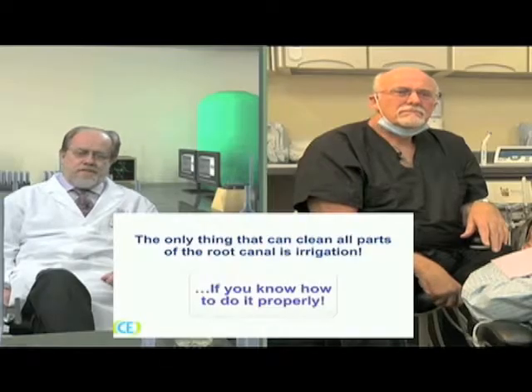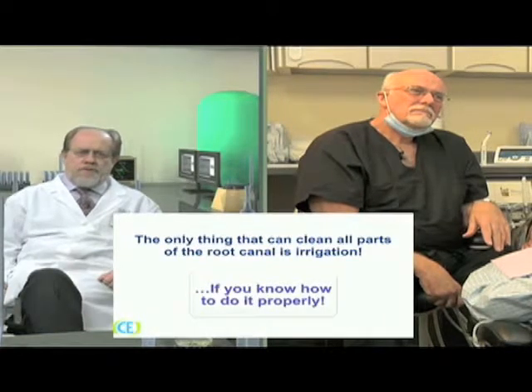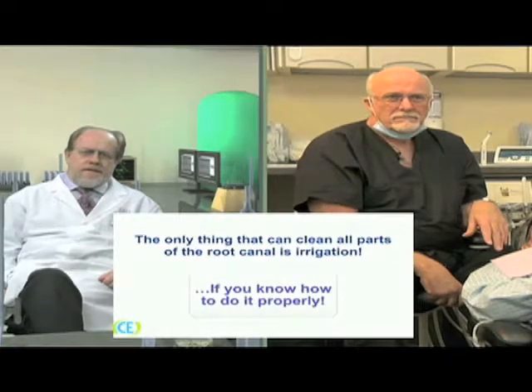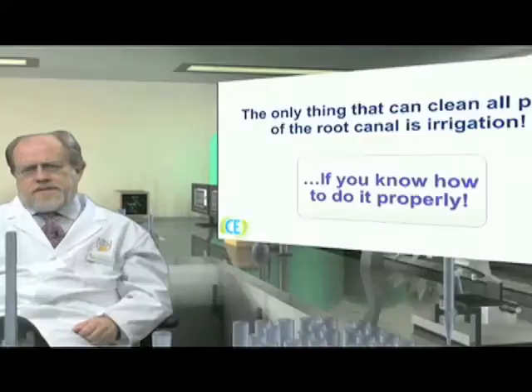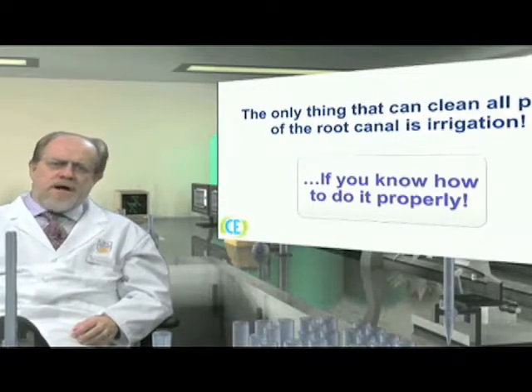Both, and I guess everybody agrees there has been tremendous development regarding nickel-titanium materials, instrument designs, and the way we are using them. And yet, as you point out, it's very important to remember that instrumentation is a facilitator. Instrumentation is creating possibilities for us to do effective irrigation and disinfection, and closer to the end of the treatment also high quality root filling.